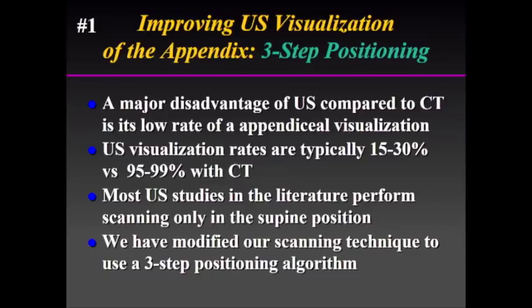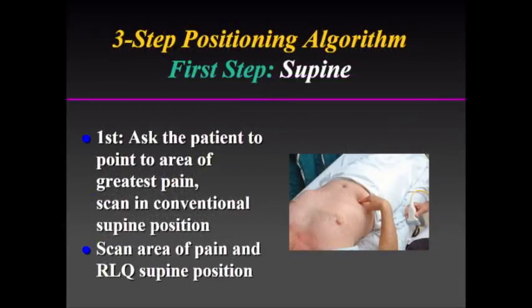So most studies have been done in the supine position, and when you think about it, what are our options available to us to improve our visualization? They involve a different acoustic window and a different transducer. And in fact, we've got to employ both of these strategies. So let's just review a few highlights of the scanning technique.